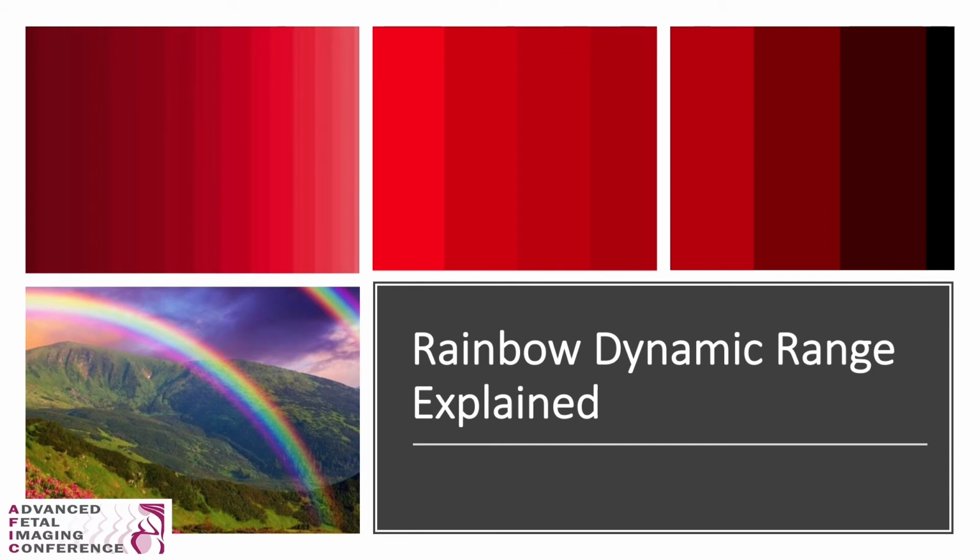This is exactly how dynamic range works for ultrasound. In an ultrasound image, if we want to make an image more contrasting or less smooth or more crisp, we can change our dynamic range. We're telling the machine, hey, I want to remove the number of shades of gray so that I can easily distinguish the different types in my tissue. Machine, move my dynamic range from 256 to 180. I don't want to work so hard to see the structure.